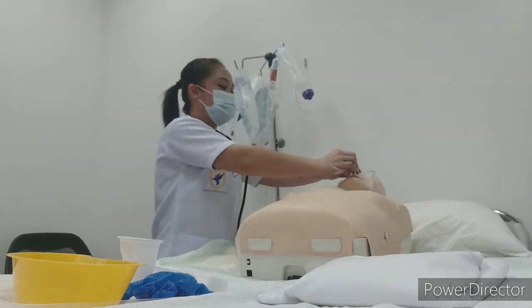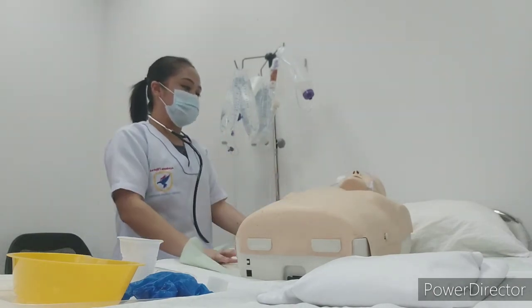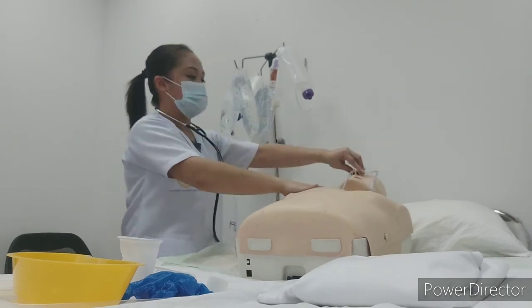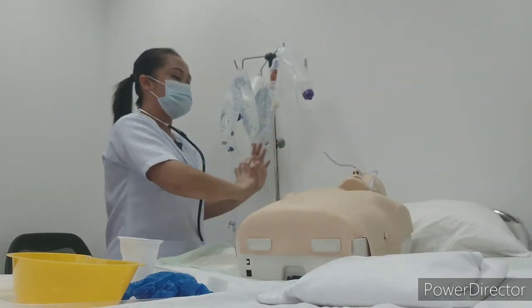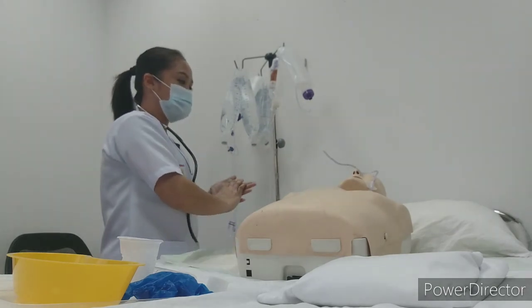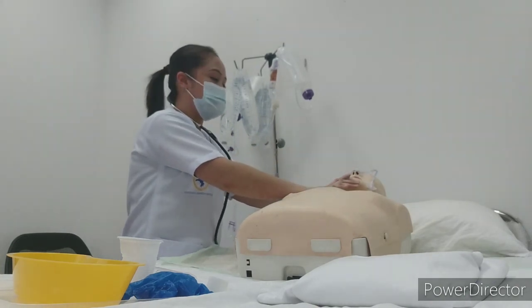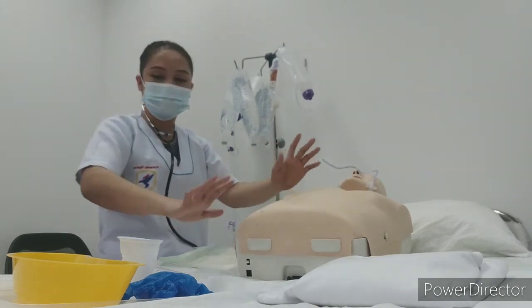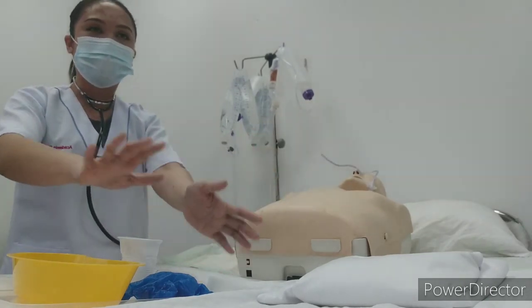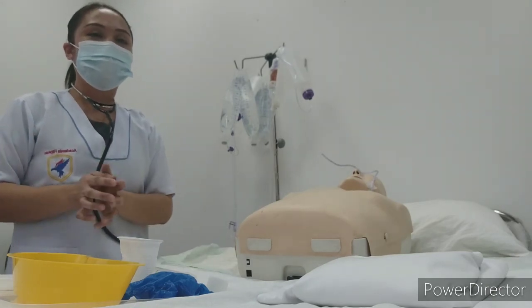So now you will hand sanitize. Then after, you will go to the patient and make the patient comfortable. Documentation: you will put the date, the time, and if the patient tolerated it or felt like vomiting. And then after this, you're finished feeding the patient. So you need to throw all the materials, the equipment you are using, into the medical waste. Okay. That's it, ma'am.